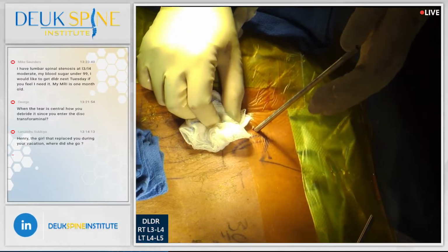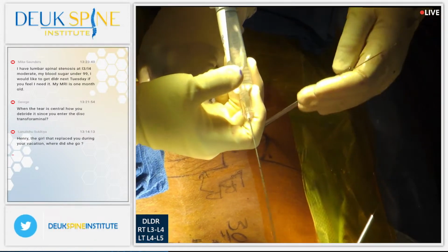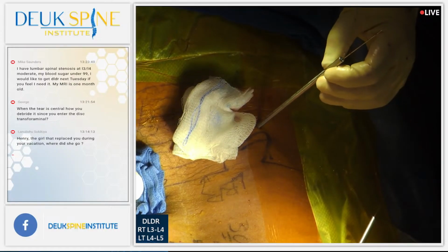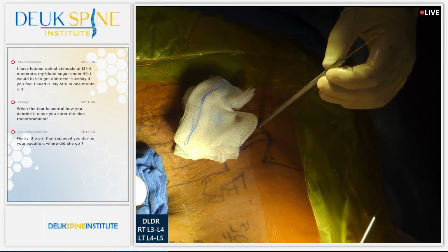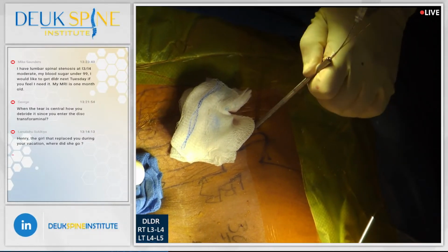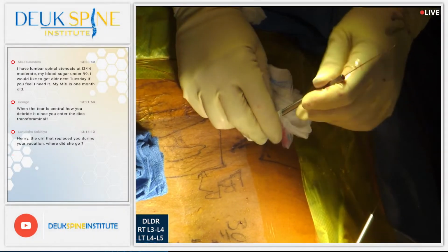I did not invent this. This was developed by surgeons much smarter than me years ago. This whole concept of guide wires and dilators. Dr. Berndes says that Dr. Seldinger is the one who invented this. It's called the Seldinger technique. I didn't know that. First used in central lines and now applied to orthopedics. But it's an established technique, this whole concept of dilators and guide wires.